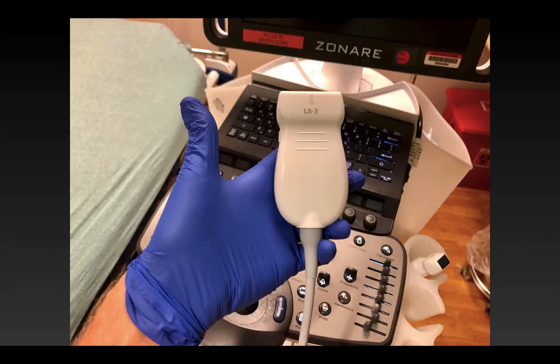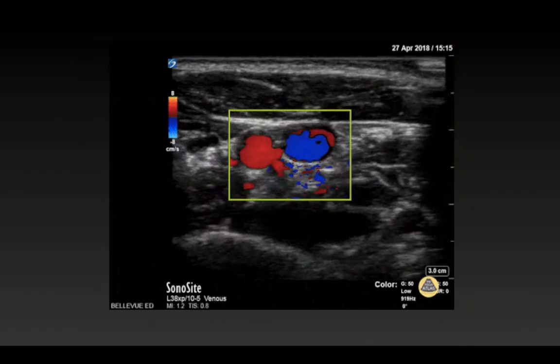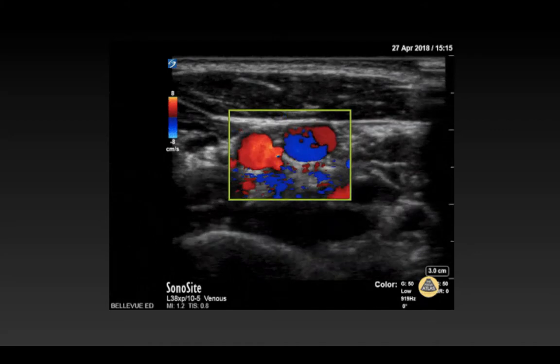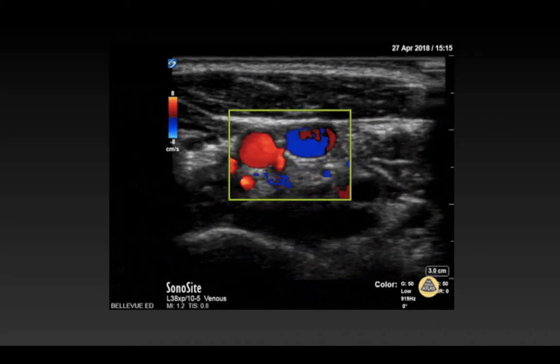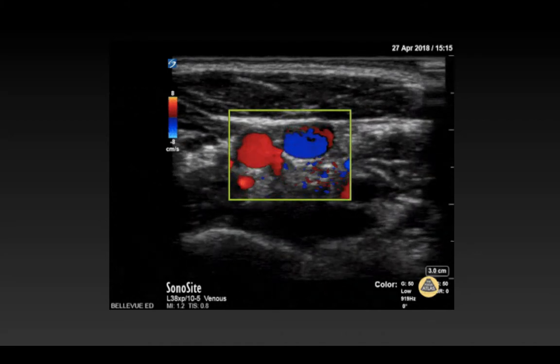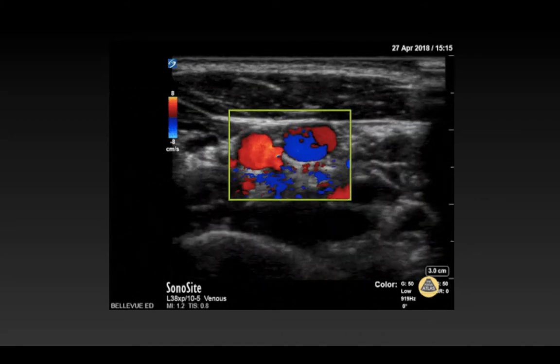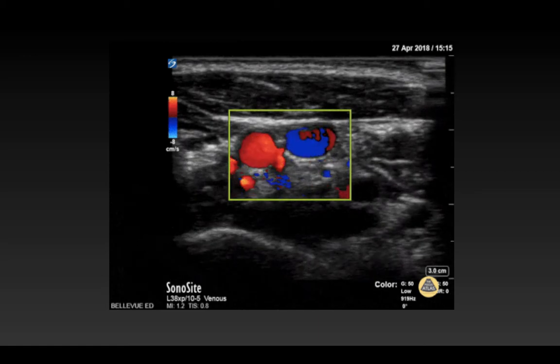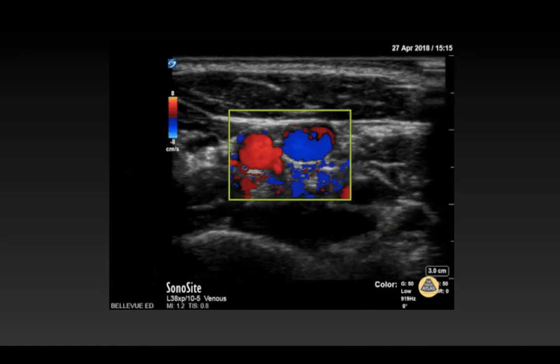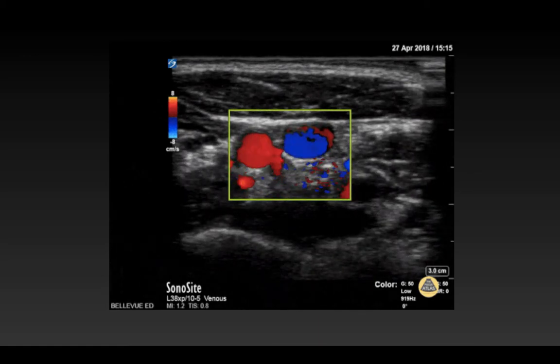For this procedure, you'll be using your high-frequency linear transducer. Now, before getting started, and once you have your patient in appropriate position, you want to assess your target vessel.